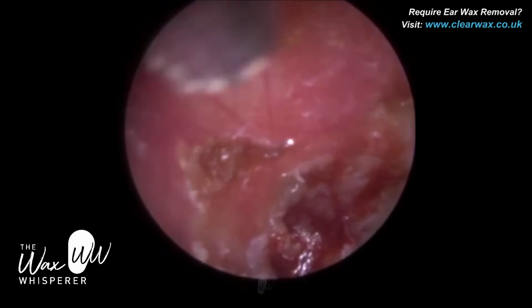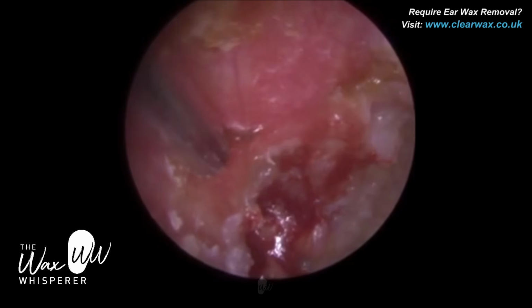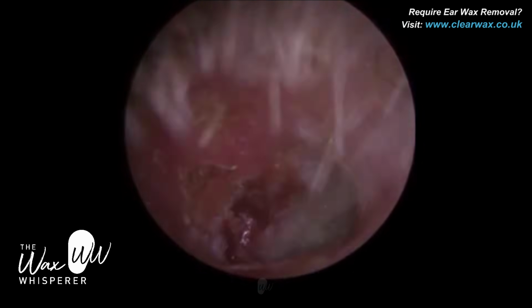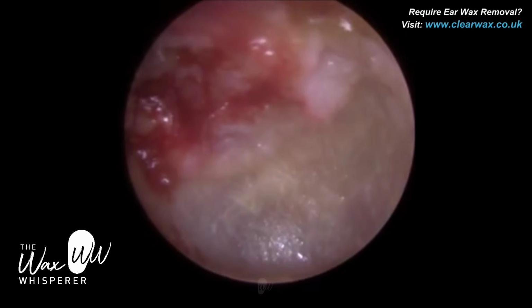So this is where the patient slightly got dizzy. So I just wanted to see if I could get it. It's very mild dizziness, but I just left it at that stage. I don't want to cause any injury or trauma to the patient, and that's the final view.